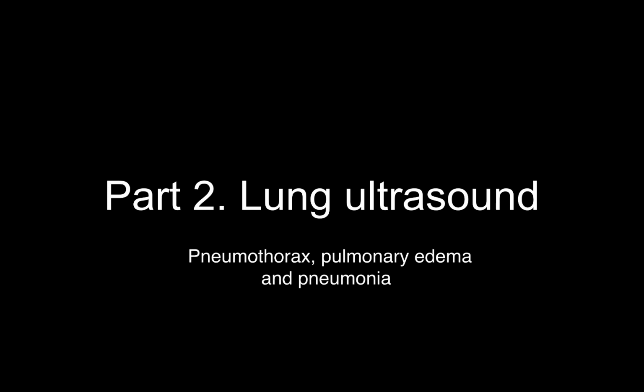So now that we know how to perform measurements on our machine, let's see how we can apply this knowledge to evaluate the lungs with ultrasound. The lung is not traditionally one of the organs we think of when we hear the word ultrasound. Air reflects ultrasound waves and has actually been called the enemy of ultrasound. So how can we apply ultrasound to an air-filled structure? It turns out that many disease states, pulmonary edema, pneumonia, pleural effusion, involve accumulation of water inside the various structures of the lung. And the accumulation of water in these diseases leads to abnormal changes on ultrasound images, sometimes called artifacts, that can give us some valuable information on what's going on inside the lungs.